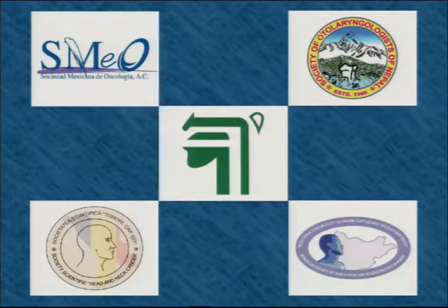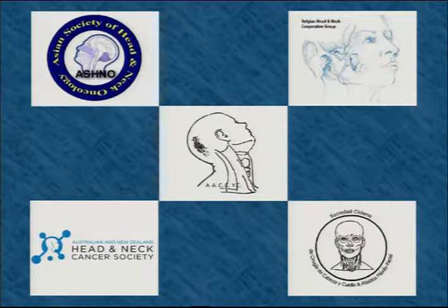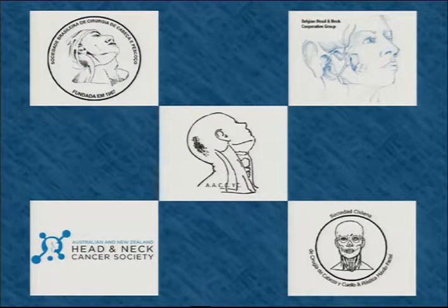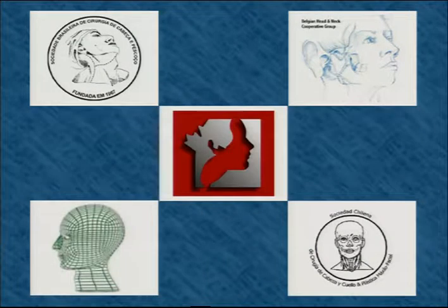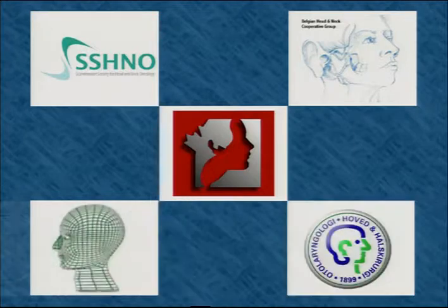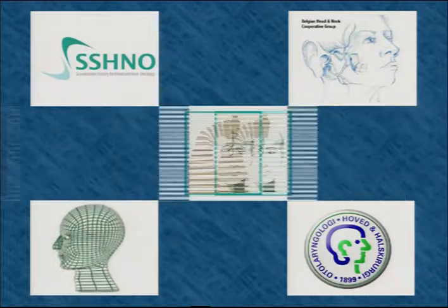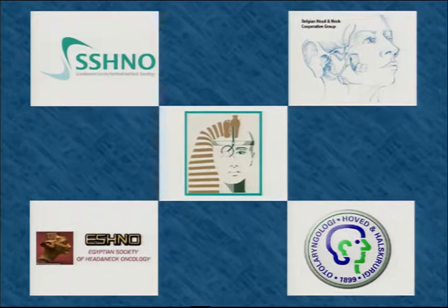But if you can keep those, the problem with such an extensive accessory dissection is that you can often get weakness, even if you do preserve it, particularly by devascularizing or denervating the nerve a little bit. And the more of that cervical plexus you can preserve, the better the shoulder outcomes are. So we tend to go from posterior to anterior and use a combination of just cut down to the nerve, and then bluntly dissect forwards with a swab.